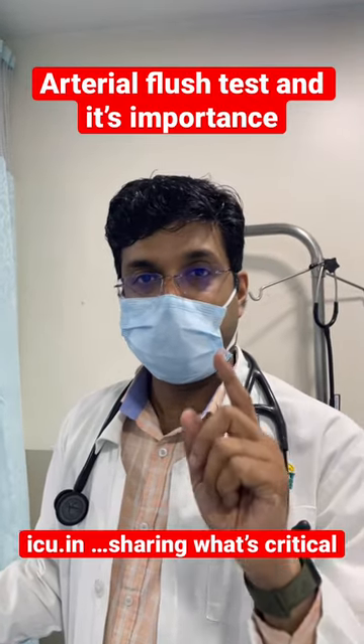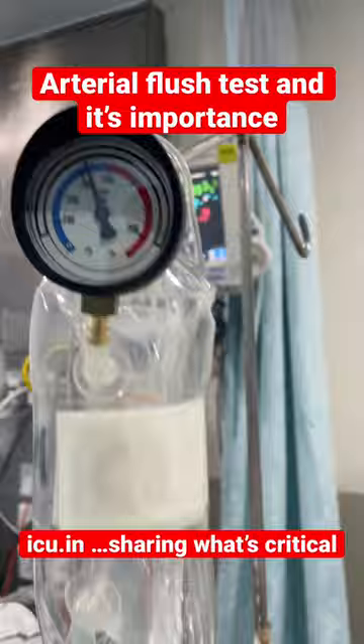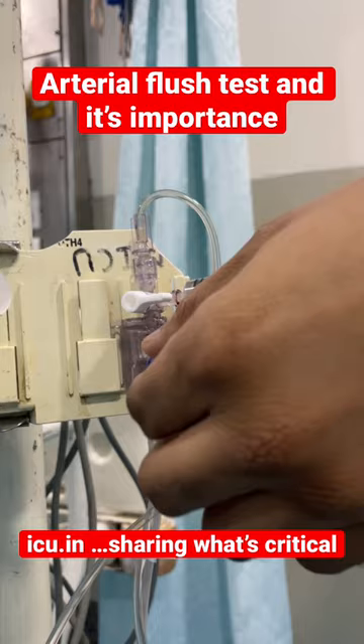Today we'll explain what the arterial flush test is and why it is important. The first requirement is that the pressure in the arterial pressure bag should be around 300 mmHg minimum. Then you should identify the fast flush valve on the arterial transducer and pull it like this.